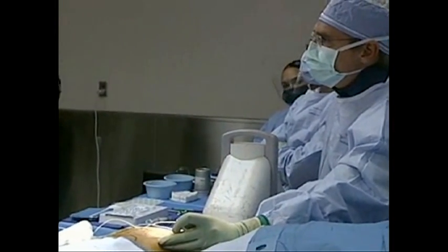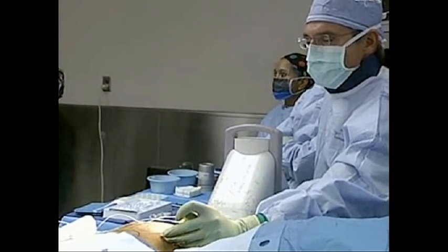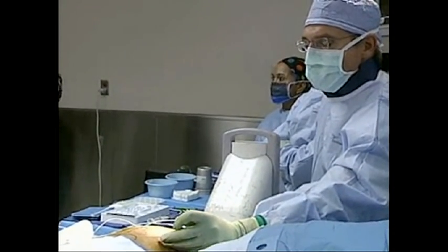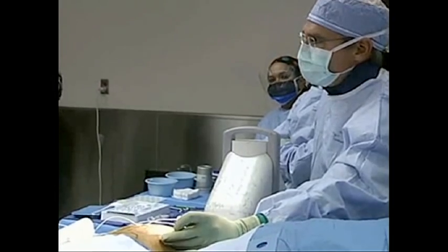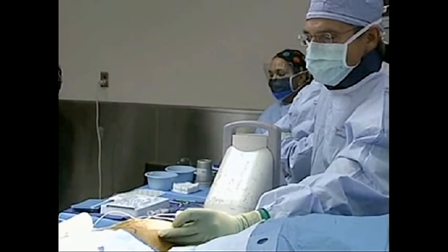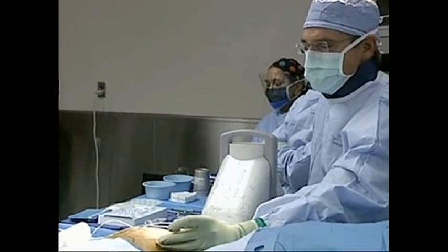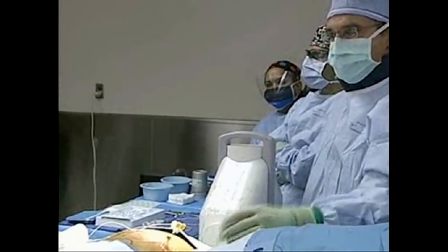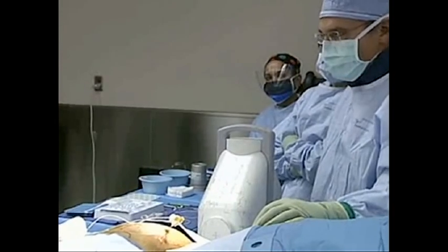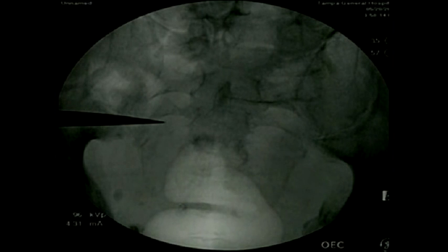I'll send it back to Dr. Odarico, who is actually placing the needle. What he's trying to do is place this on the patient's right side. He's going to take a moment and change the fluoroscopy image — going to an AP view to make sure that in terms of positioning, medial or lateral, he's where he wants to be.